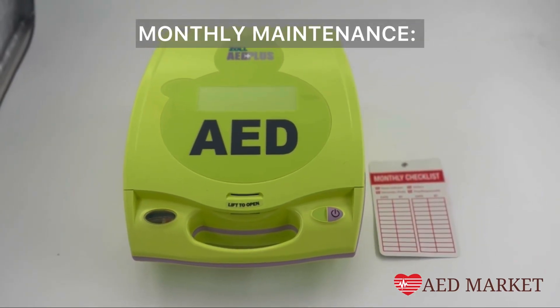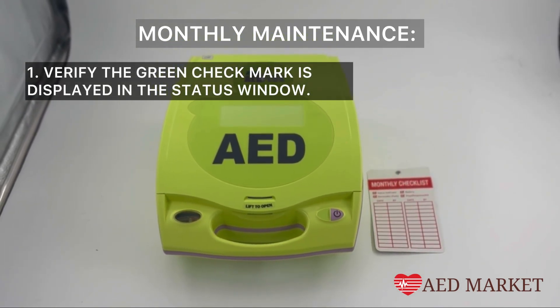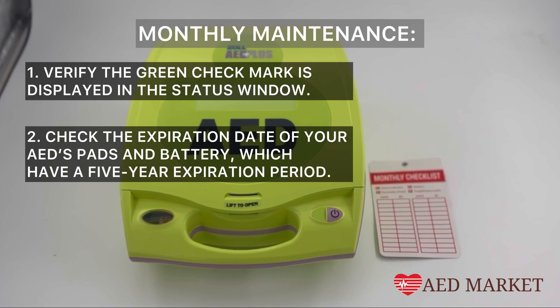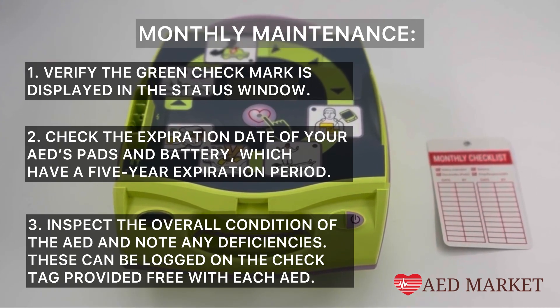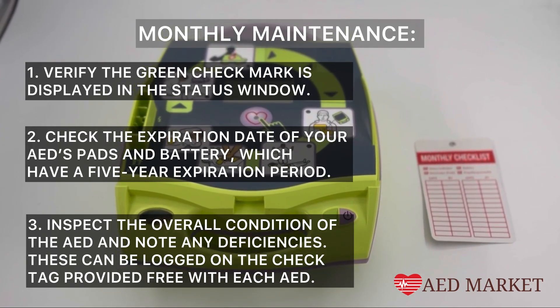Each month, you'll want to perform three key tasks. 1. Verify the green check mark is displayed in the status window. 2. Check the expiration date of your AED's pads and battery, which have a five-year expiration period. 3. Inspect the overall condition of the AED and note any deficiencies. These can be logged on the check tag provided free with each AED.